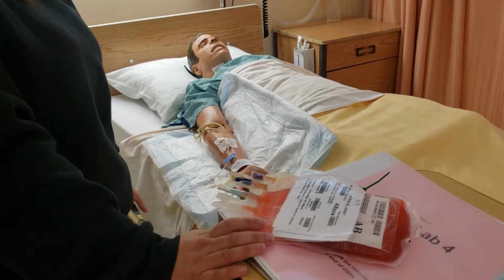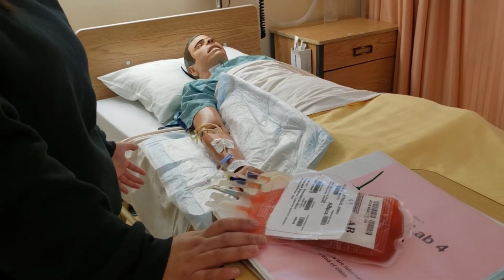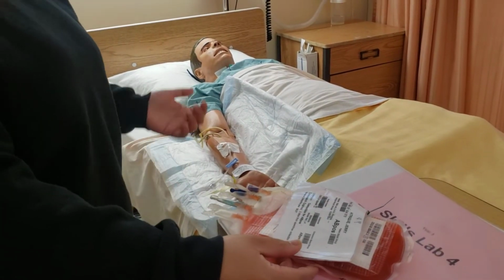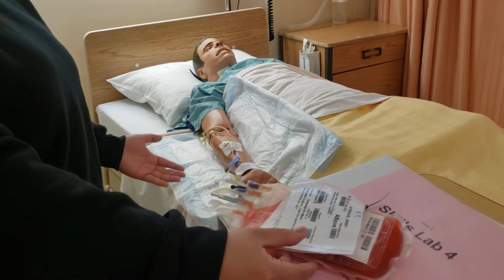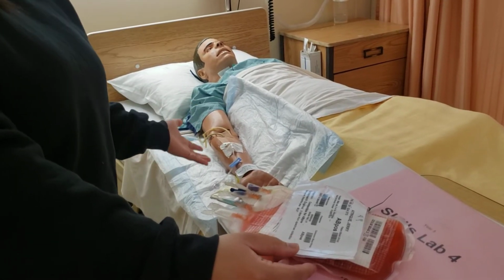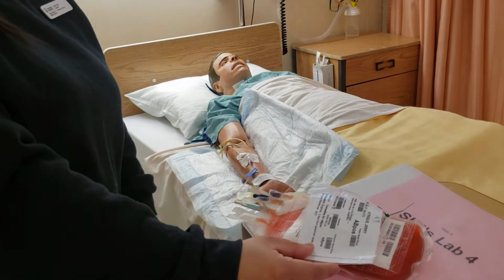Jerry, your doctor has spoken with you earlier today, and your blood results show that you have a low hemoglobin, so that's why the doctor has ordered blood product to be transfused to increase your hemoglobin levels. I also noticed that you signed the consent form that's in your chart when you spoke with your doctor. I just want to make sure that you still consent to receiving the blood product. If they do agree, then we will go ahead with the transfusion.